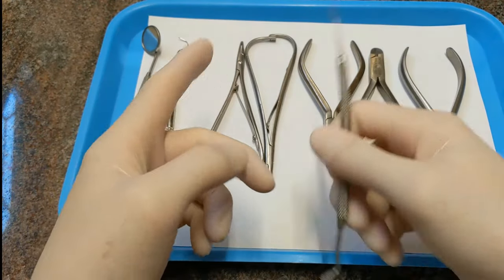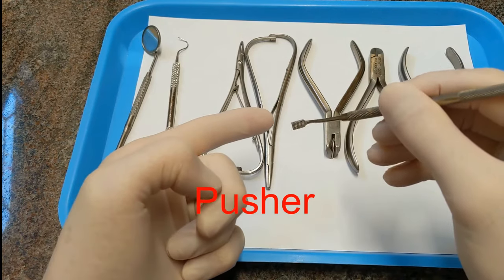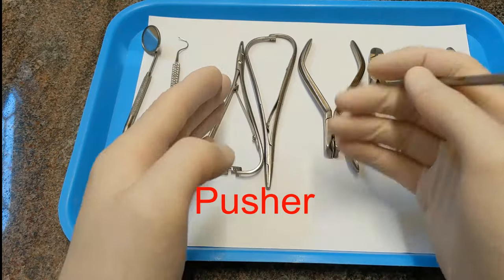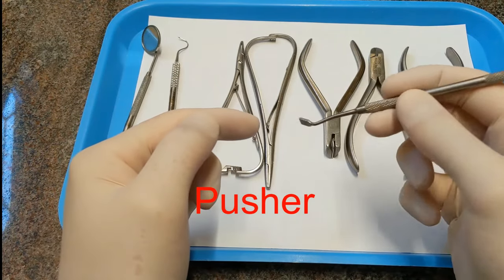The other side of the scaler is called a pusher. This is meant for pushing bands onto the teeth or contouring bands into the side of the teeth so that it matches the contour of the tooth. That's called a pusher.